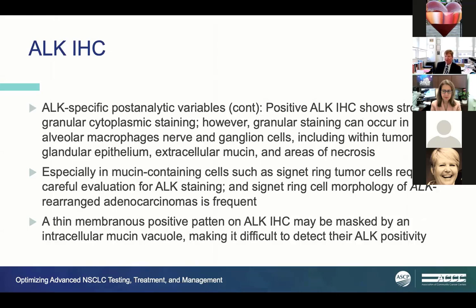There are additional post-analytic variables. These ALK stains are very granular in the cytoplasm of tumor cells, but granular staining can also appear in alveolar macrophages, nerve cells, and ganglion cells within tumors—which can be difficult to discern. Sometimes glandular epithelium, mucin, and necrosis can attract staining as well. Mucin-containing signet ring cells, where mucin pushes cytoplasm and nucleus to the side, require careful evaluation to avoid over-calling or under-calling positivity.